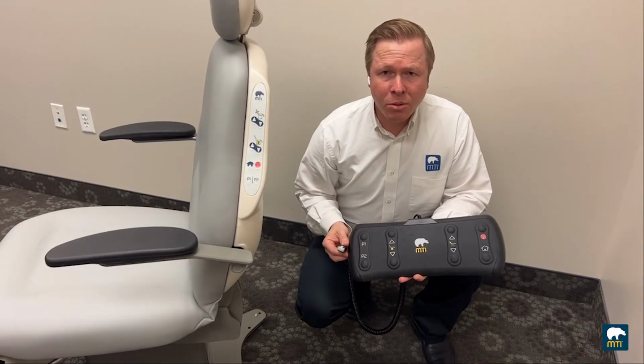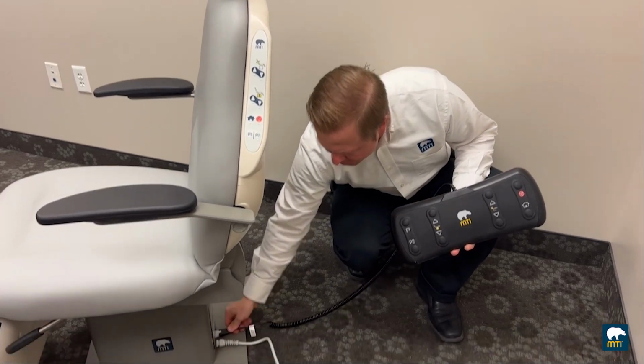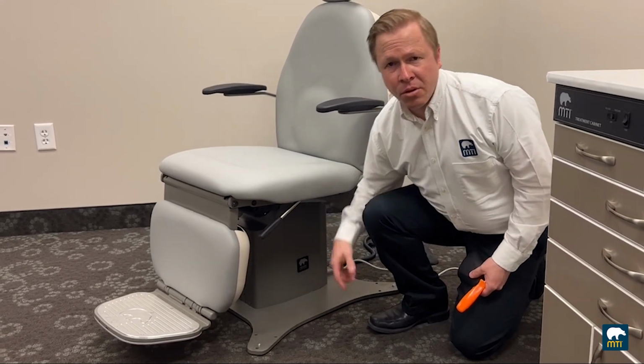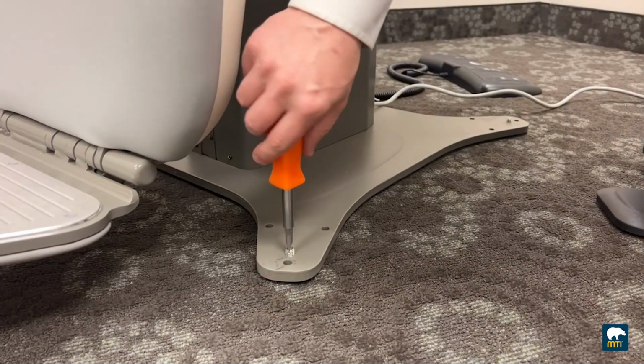If you purchase the optional foot control, insert the plug with the locking clip up into the back of the chair. Your 461 and 403 models both come standard with leveling glides on each corner. If your chair is not level, you can use a flathead screwdriver to adjust each level up or down.